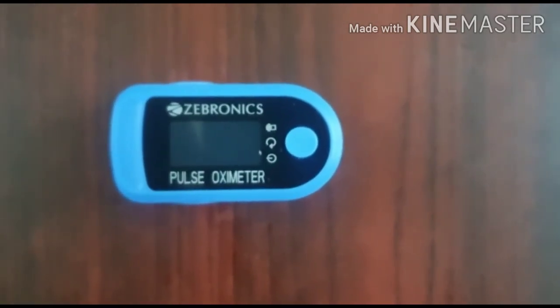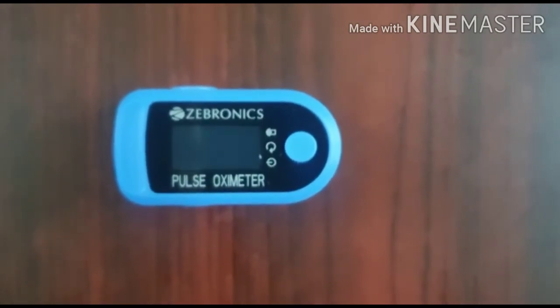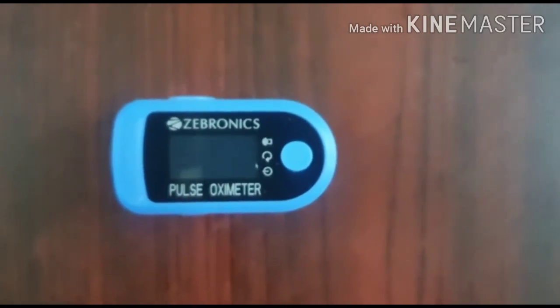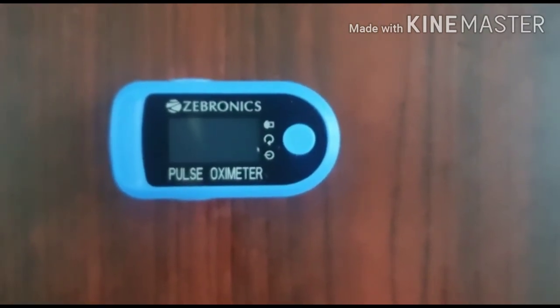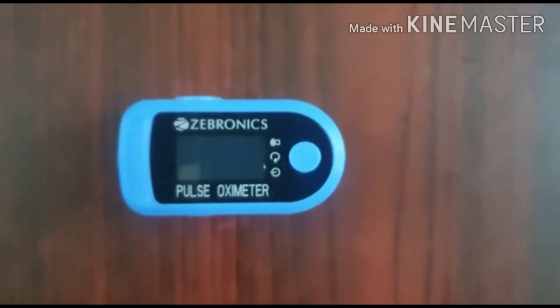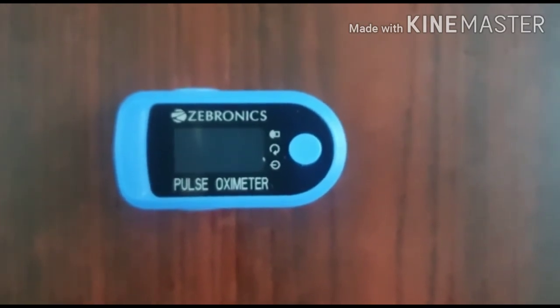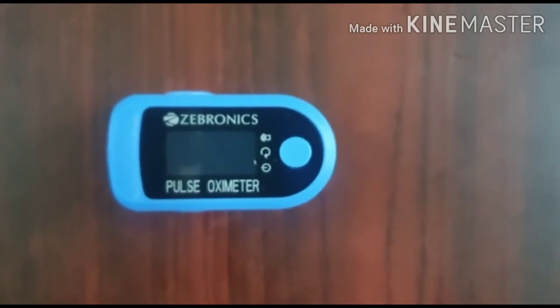I am saying this not to scare you all, but just to create awareness. The other reading is the pulse rate — the rate at which the heart is beating, measured in beats per minute. If it's between 60 and 100, it's good. These beats can go up to 120, but beyond 120 it's an alert, and below 60 it is an alert too. If it goes below 60, you have to consult a doctor immediately.